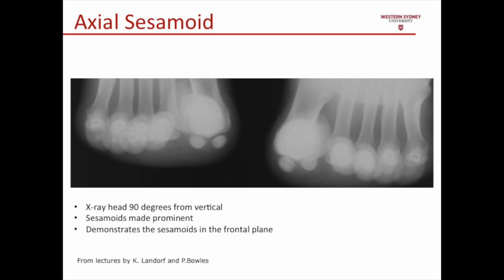If this were a weight-bearing view, the soft tissues would adapt to the supporting surface and would appear flat. This view is particularly useful to look at the articular facets between the sesamoids and the plantar surface of the first metatarsal. You will note that you should see a visible joint space which would represent the cartilage.